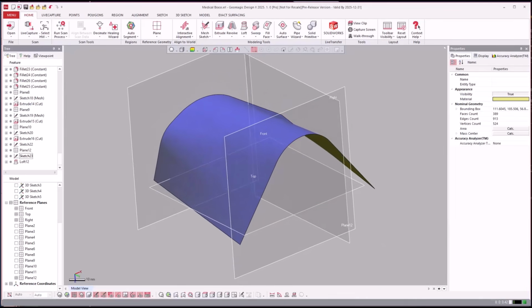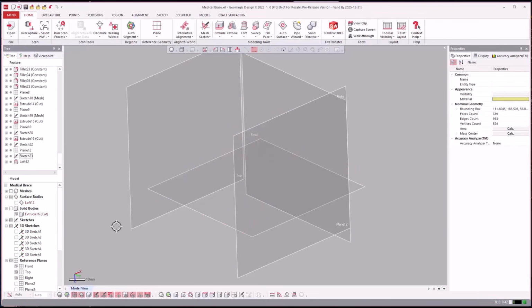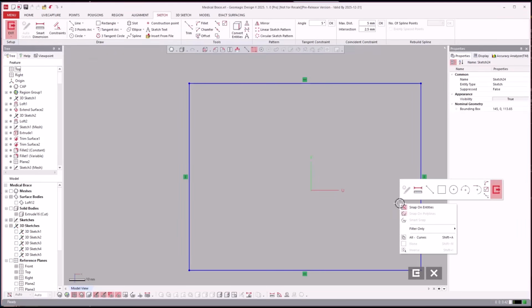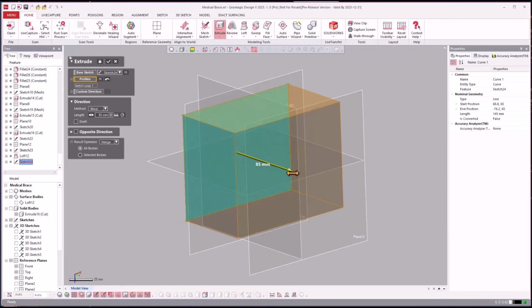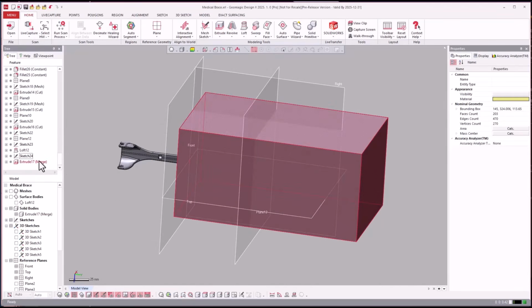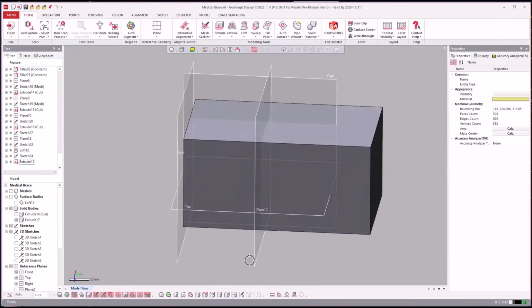Now, another one that I wanted to bring up here as we hide this, let's just come on in and just create some basic geometry. Extrude it. Just give it a little more length there. Hit OK. Now we're going to turn on our solid. And you see one mistake I did is in the newest version here, sometimes it has merge by default on there, which is a lot like what SolidWorks does. So it merged it with it, and I didn't want it to do that.